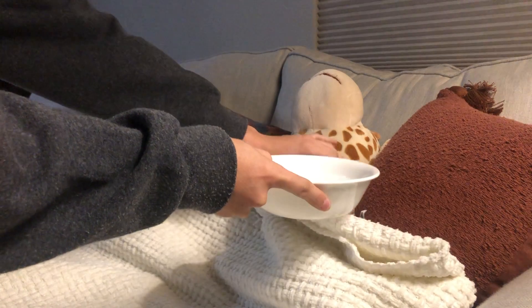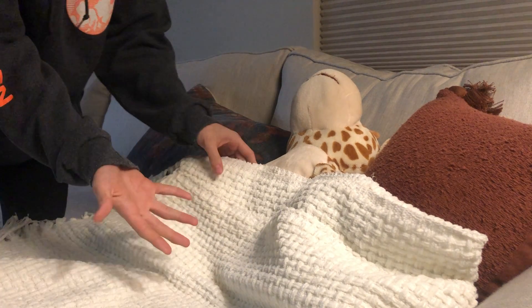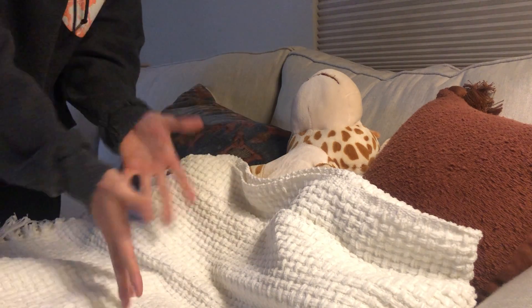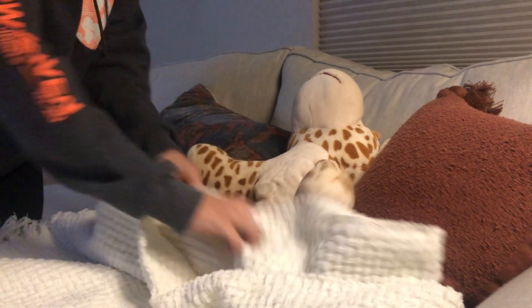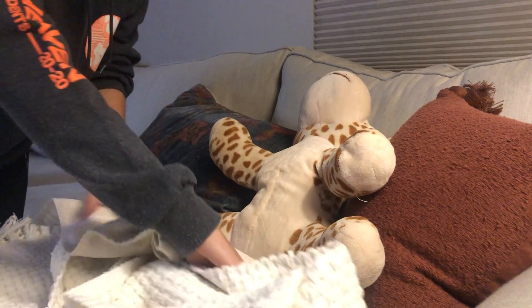I have a bowl of water right here. I'm putting on my clean gloves. I'm going to expose from the hip to the knee area. I'm placing my linen protector underneath her so it doesn't get on the surface.